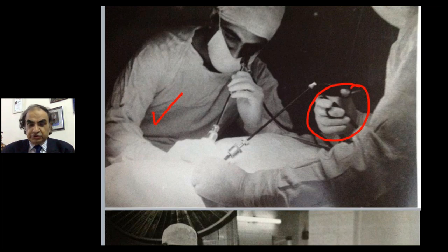If you don't have two ports, you cannot do diagnostic laparoscopy, and it should not be done. That is the message here, and that you can recognize is me. If you can't, my fault.